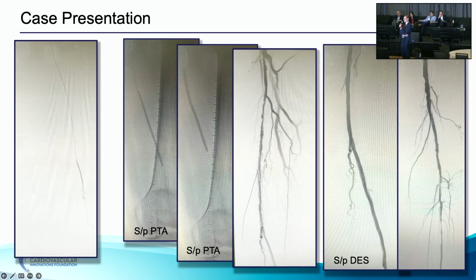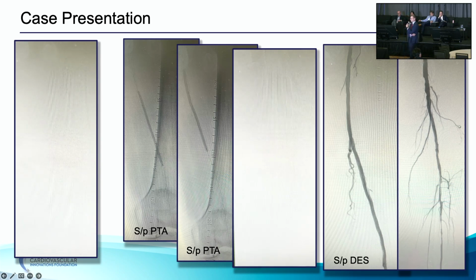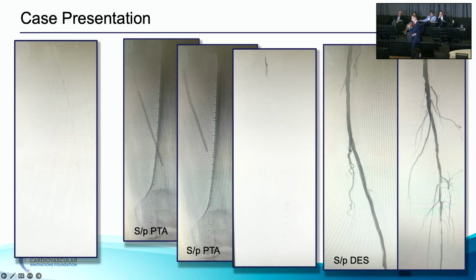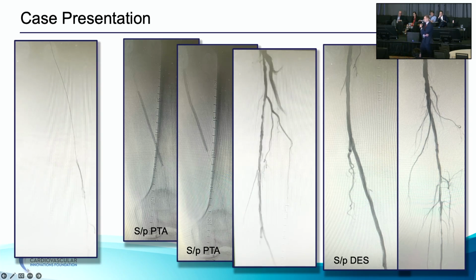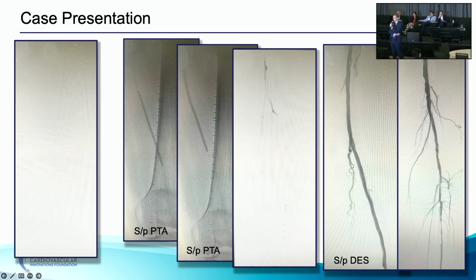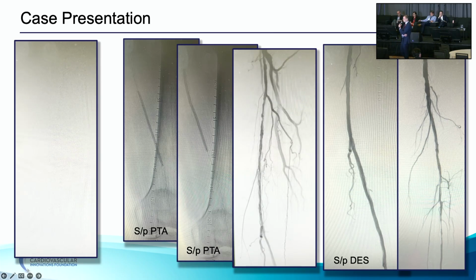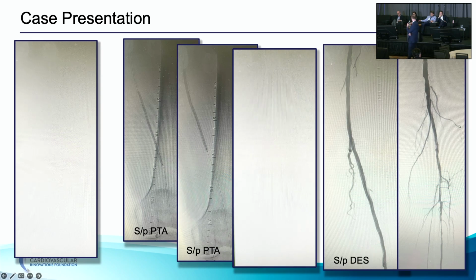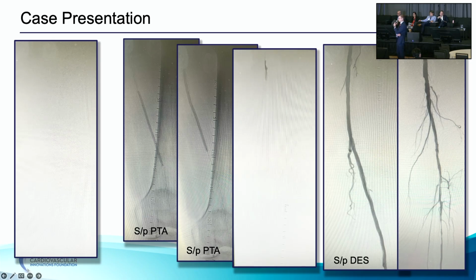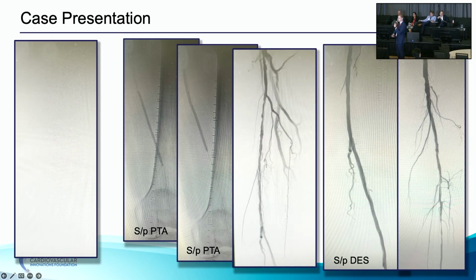You can see this is the injection on the left side through that to make sure that I am in the distal vessel. I do have to agree, and I think the panelists will comment on that, I did re-enter a little bit further down than I wanted to. So I think going retrograde in retrospect was certainly an appropriate suggestion. This was followed by balloon angioplasty.